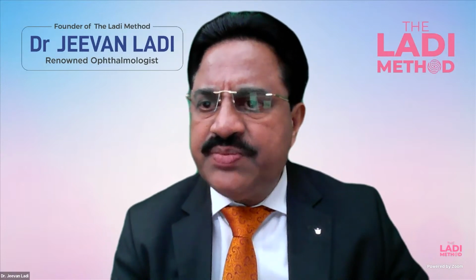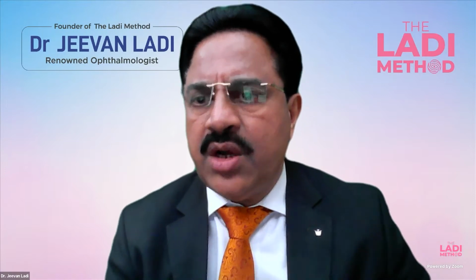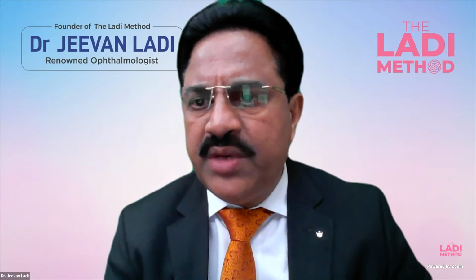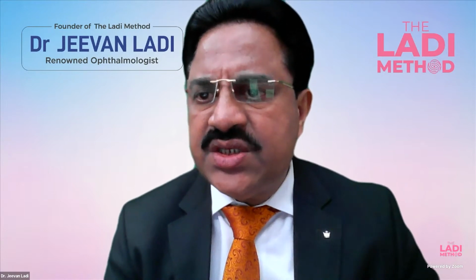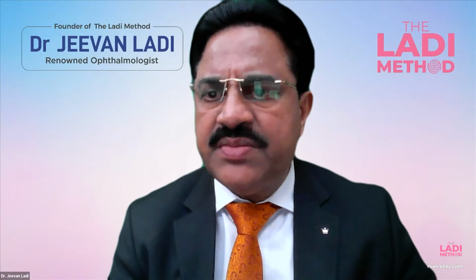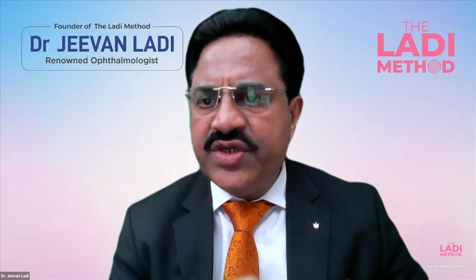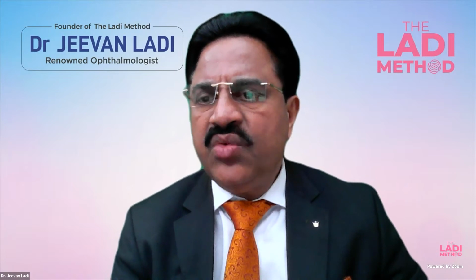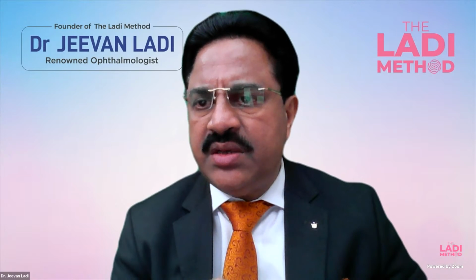Now, if you see in these patients, all the patients were operated with a 2.2 millimeter incision. And SIA, that is the surgically induced astigmatism, is a value which each surgeon has to calculate of his own. Like, where do you start your incision? Do you start a little bit behind the limbus?